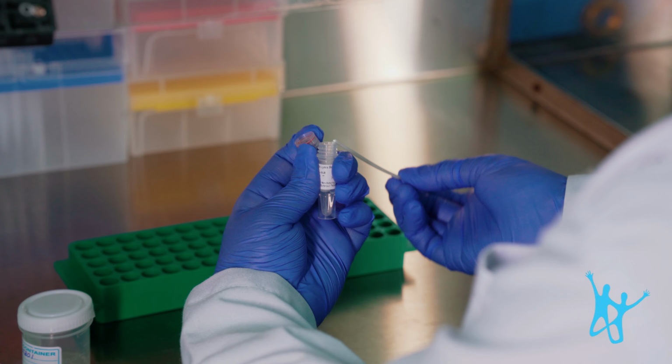The sputum sample collected in a sterile container must be properly labeled. Refer to the sample collection, transport, and storage guidelines for detailed instructions. Use only the sterile swab provided with the kit for sample collection. Do not use any other swab, as it may impact assay performance and test results.